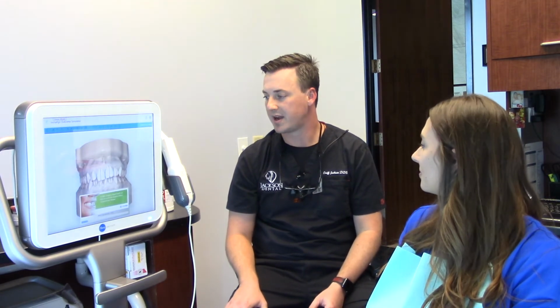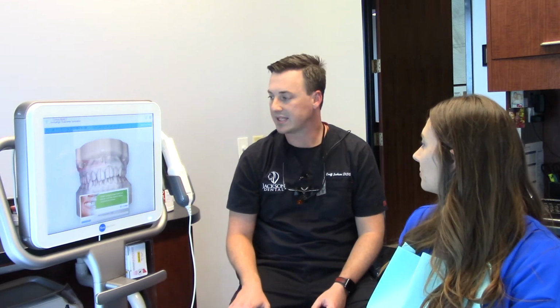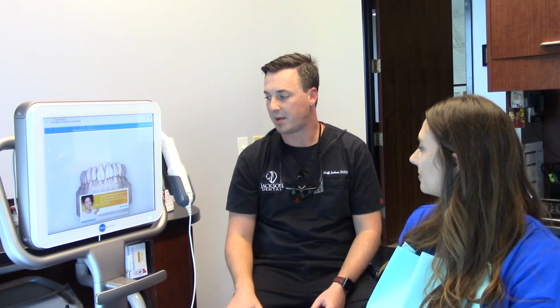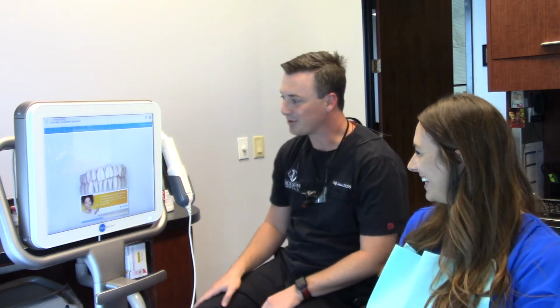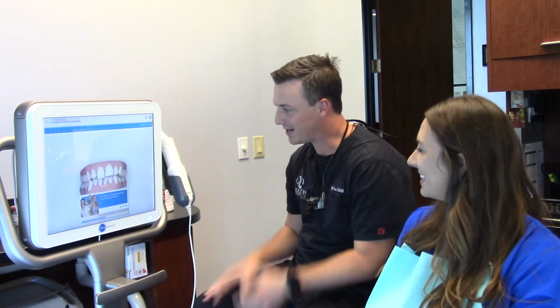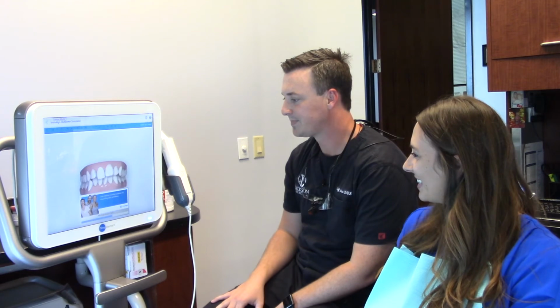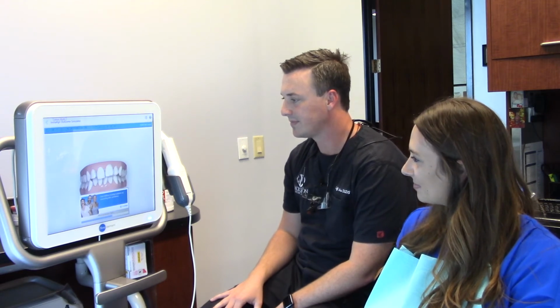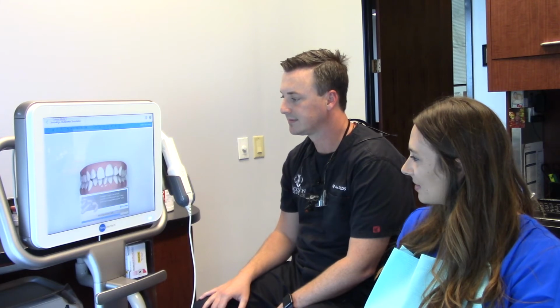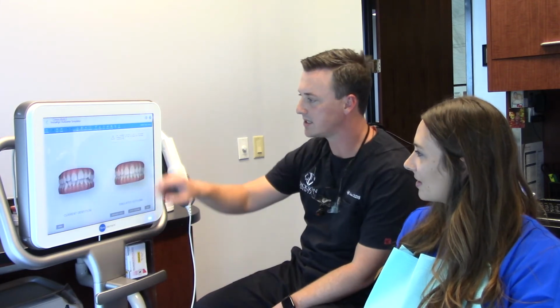There's a huge preventative component to orthodontics, and that's really the reason we're talking about this today: to prevent future wear, future problems, and avoid coming to the dentist as much. I know you love coming to see me, but let's try to minimize that as much as possible, right? Keep it cleanings only. Let's get a little sneak peek of what it looks like. All right, so here we go.